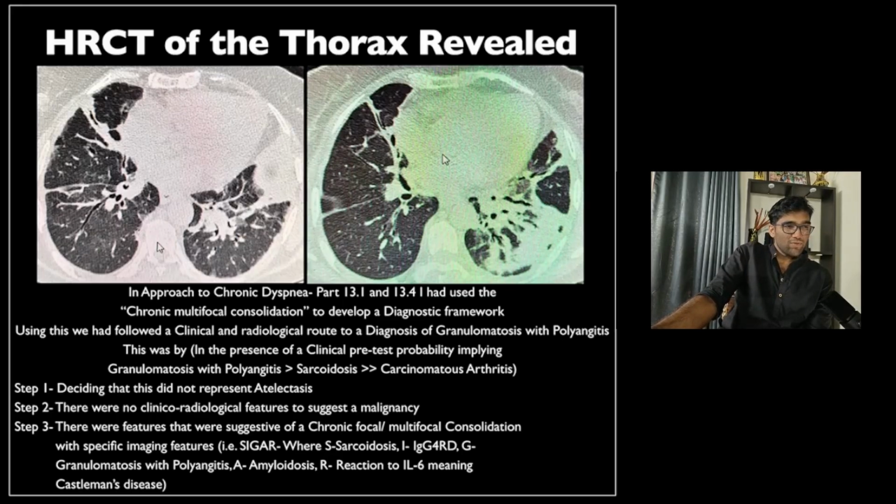So I alluded to some of the specific imaging findings of GPA in that talk, and because of that, we eventually decided that GPA was the most likely pathology. But then we found that the patient's C-ANCA titer was also highly elevated, corroborating this presentation. And then the patient subsequently responded to immunosuppressive therapy with low dose steroids as per the PEXIVAS protocol, and then rituximab for induction and for maintenance.